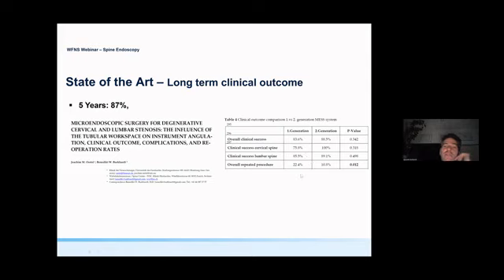They were very satisfied. But even though reoperations after 5 years were still there, 20% in the first generation, 10% in the second generation, especially a difference we had for the cervical spine, where we probably had a very high learning curve, first of all, and second of all, the indications for our endoscopic posterior cervical foraminotomies were very, very strict. I think especially in the cervical spine, if you do a posterior approach, you have to be very strict to get a very good clinical outcome, because the anterior cervical discectomy still is, also in the long term, a very successful procedure.